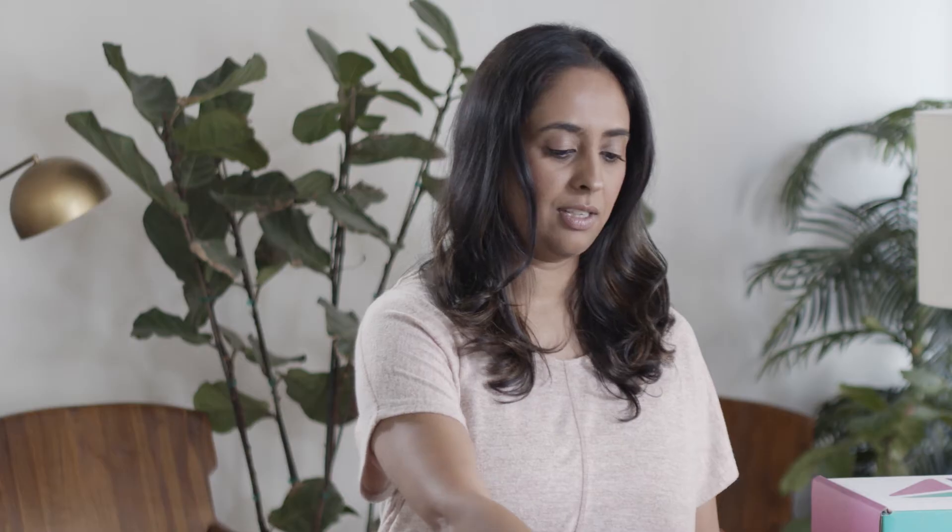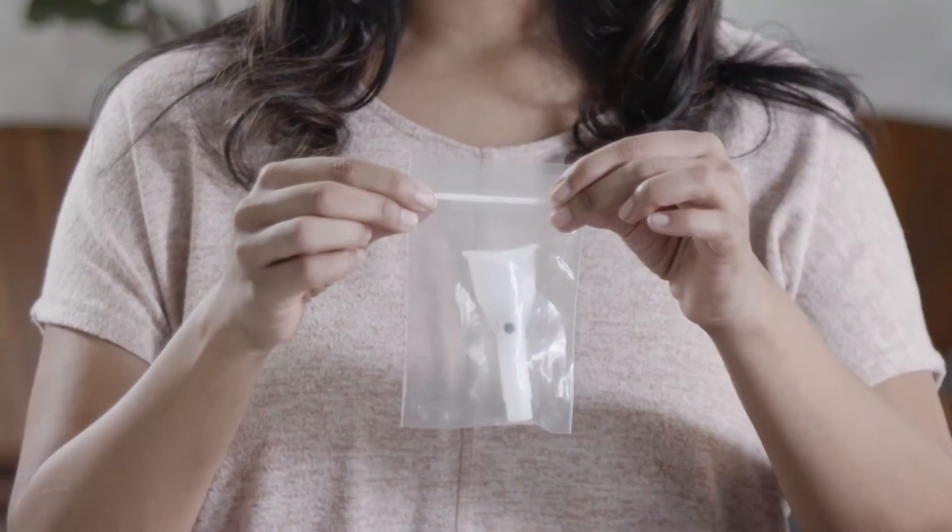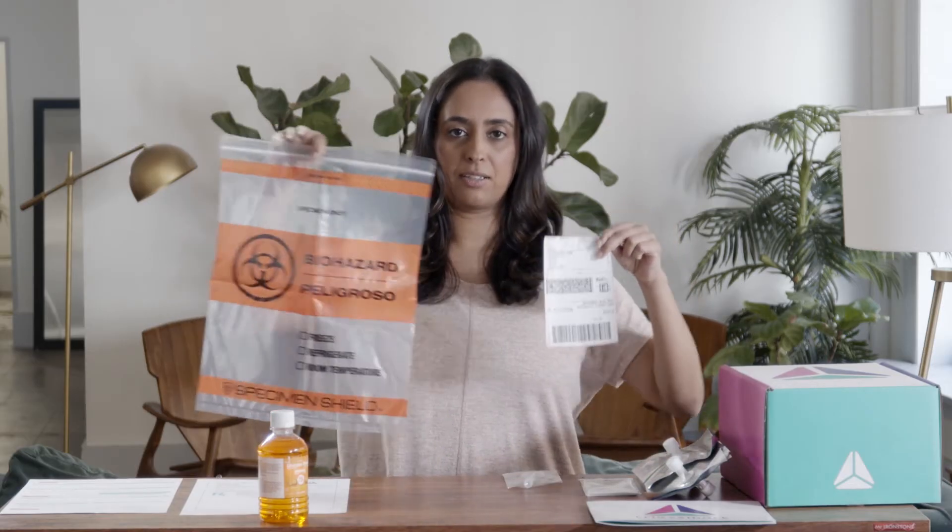One sample collection instructions manual, nine breath sample collection bags, nine sticker labels — one for each bag, one reusable mouthpiece with a small hole on top — you'll use this for each bag, one biohazard bag, and a prepaid shipping label.